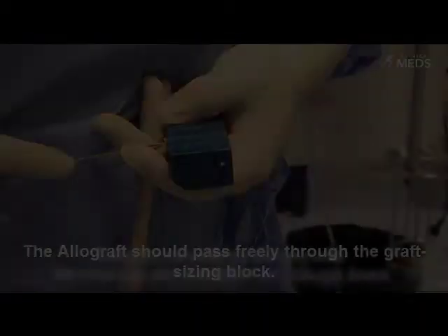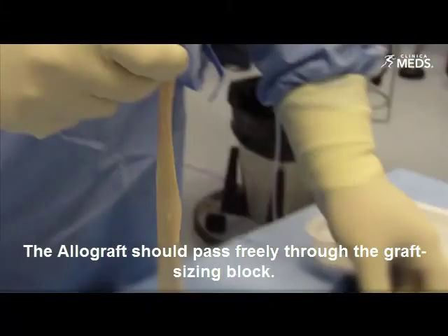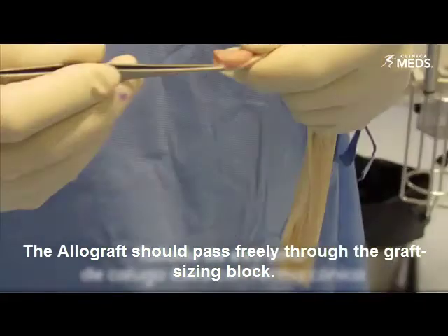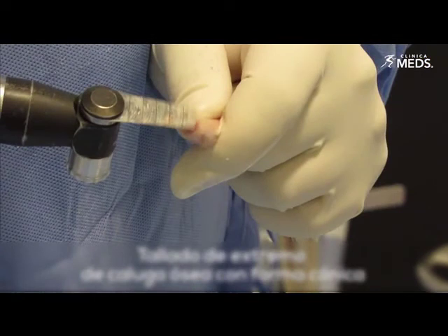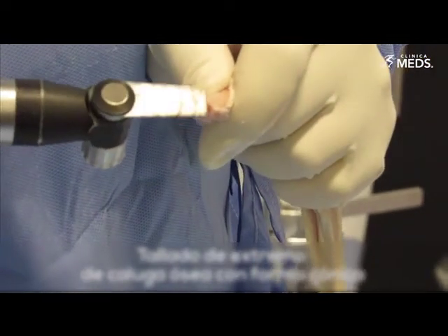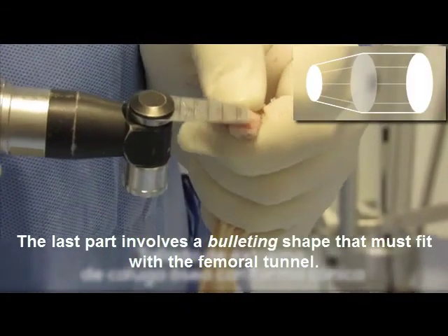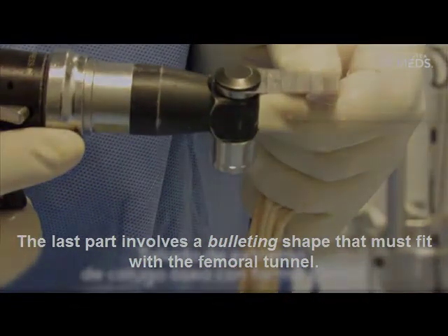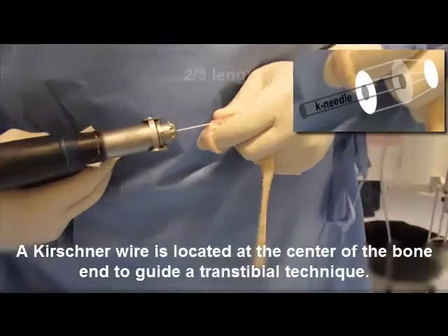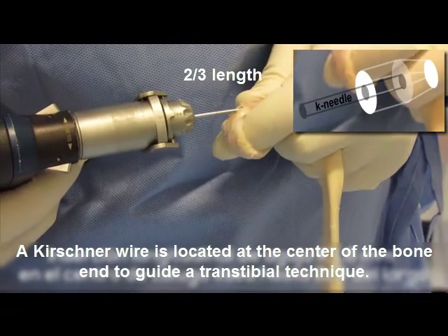The allograft should pass freely through the graft sizing block. The last part involves a bullet shape that must fit with the femoral tunnel. A Kirschner wire is located at the center of the bone end to guide a transtibial technique.